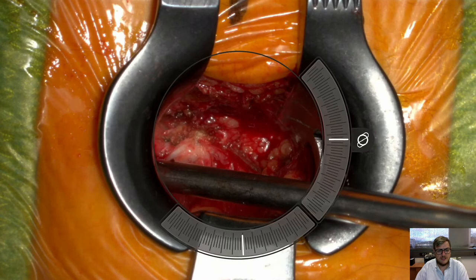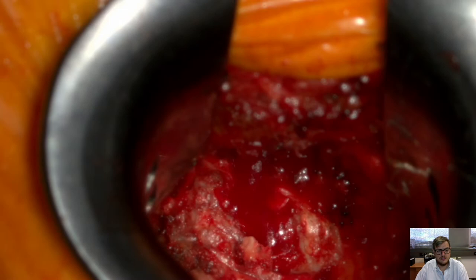This is the exposure of the interlaminar window. You see how to use the orbit mode to put it more into your view, more centrally.